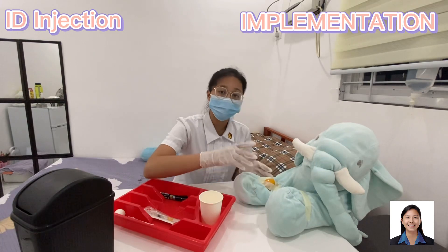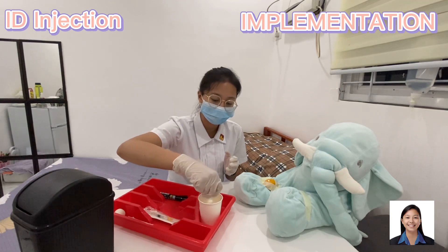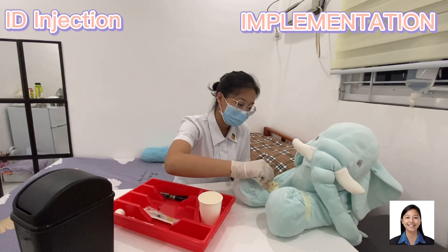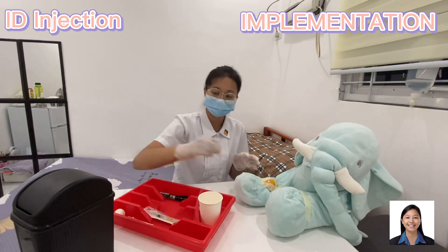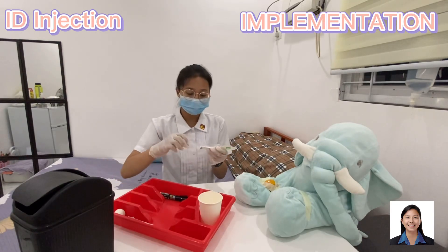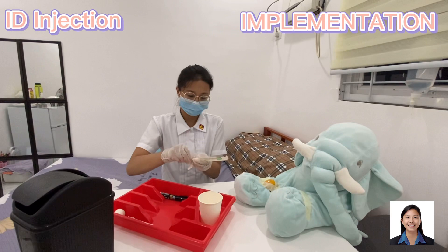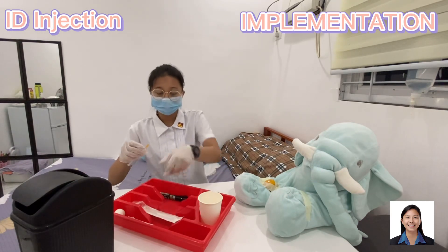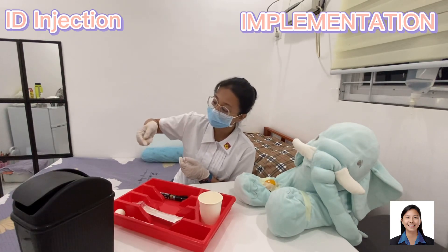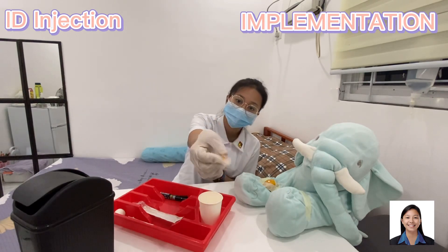After locating the site on the patient, wipe it with alcohol — first the inside, then outside, in a circular motion. Then uncap the needle. Hold the syringe between the thumb and four fingers with bevel up, just like this.